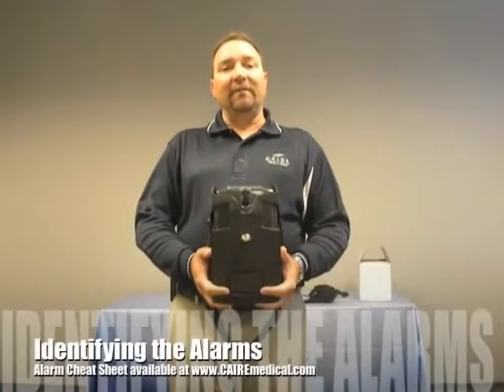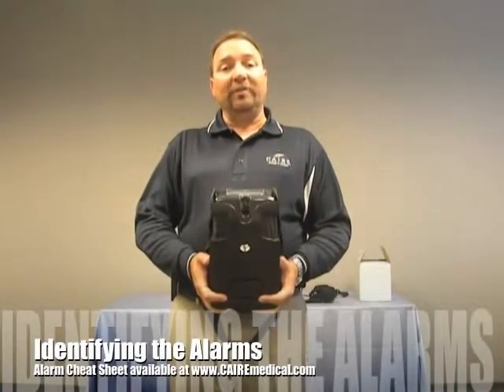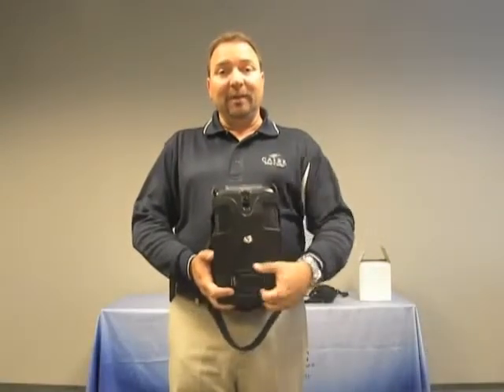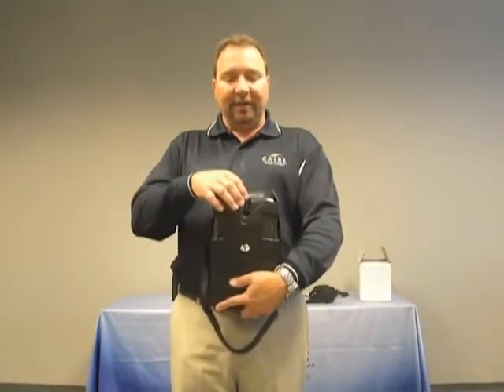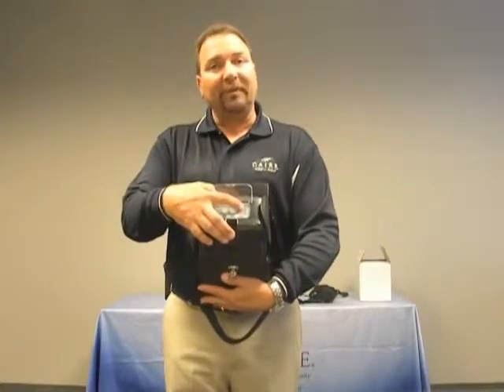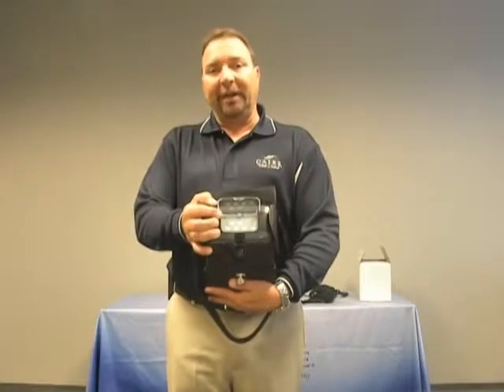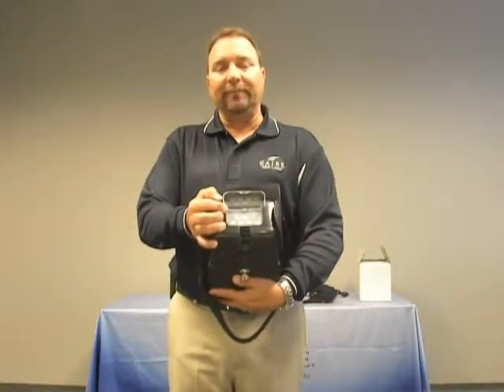Today we want to provide a video that gives you instructions to identify the alarm systems of the FreeStyle 5. There are several alarms, a total of 5 with the FreeStyle 5, that can be easily identified. In looking at the control panel, you're going to see both a battery scale as well as an LED light in the upper right-hand corner where my finger is pointed.